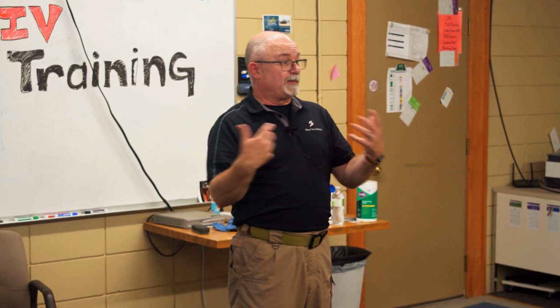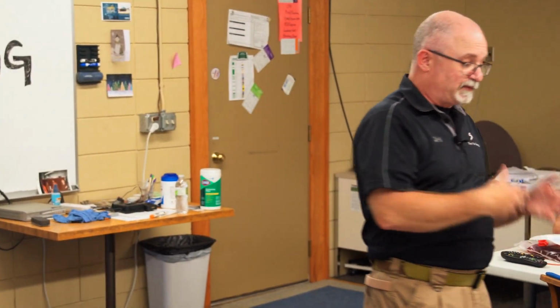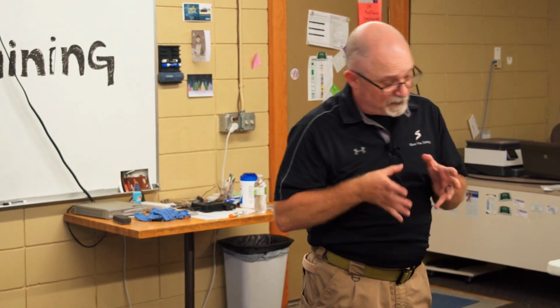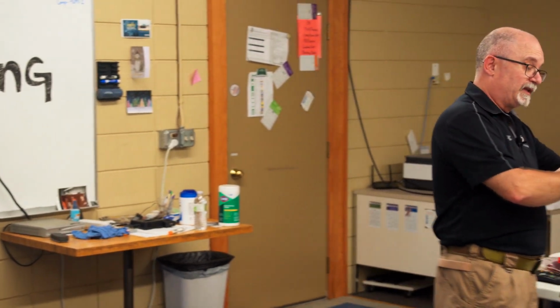So let's take that big multi-trauma, big patient, maybe bleeding. We have them out and accessible. Getting them in the back of our truck and getting going and doing it on the way is probably more beneficial, because if we're sitting around here trying to get an IV, we're focused on this neat little toy we have to play with, we're taking that time that they could be having a definitive, actual treatment at the trauma center. So not necessarily, we've got to get this IV. Now we're going to talk about a couple of specific examples, but for the most part, this is an add-on so that they can get blood or whatever else they need when they get to the other end. So being able to get that done there is better.